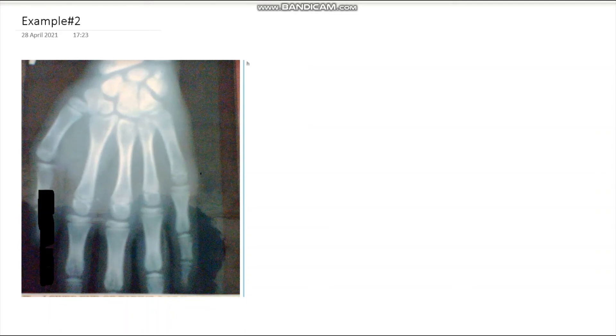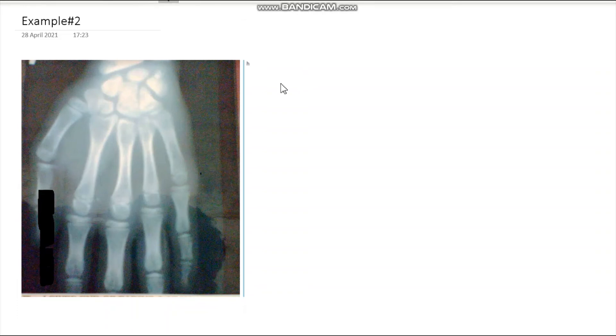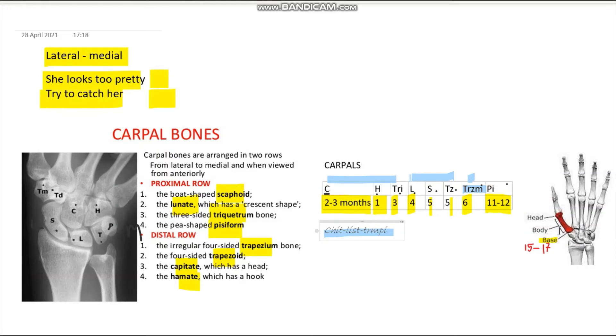Example three: this is an X-ray of the wrist. From lateral to medial we can identify: Scaphoid, Lunate, Triquetrum, Pisiform, Trapezium, Trapezoid, Capitate, and Hamate — all of them have appeared. The last carpal bone (Pisiform) appears at 11 to 12 years of age, so this person is definitely more than 12 years of age.